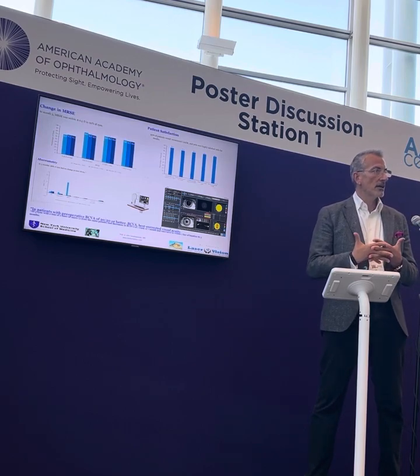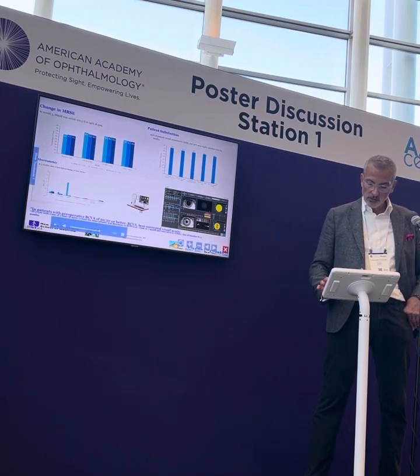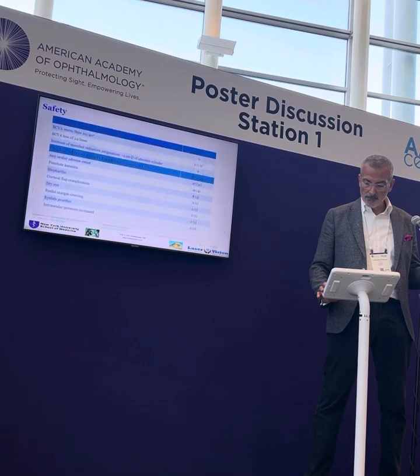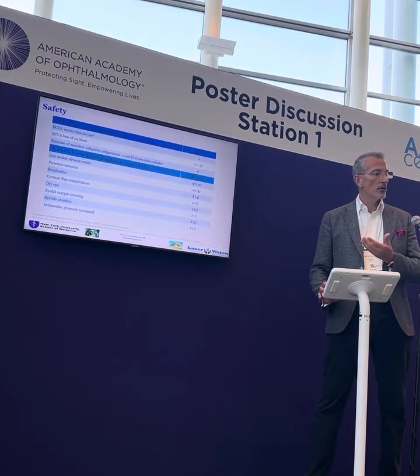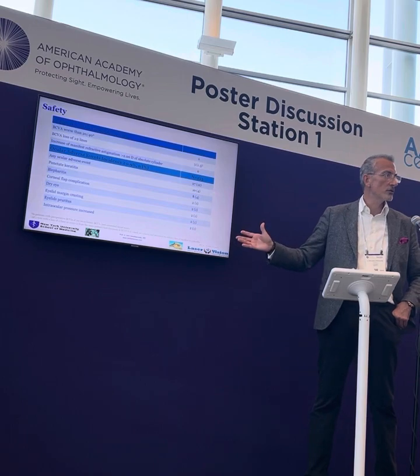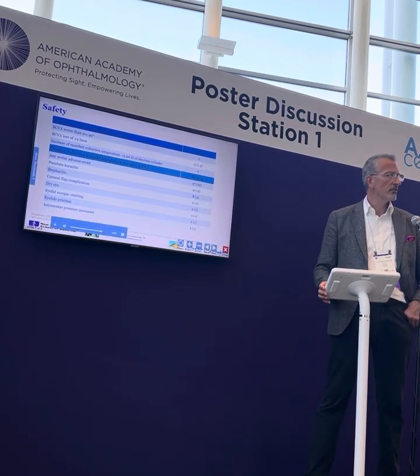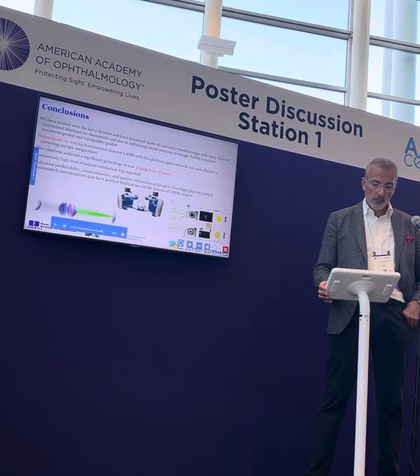especially when we're treating eyes over -3, even in the range of over -5. There was a very subtle increase in higher order aberrations, underlining the importance of correcting preemptively higher aberrations with this device. So as far as safety, this is a list of all the adverse reactions noted with these patients. We just had one incomplete flap in the group from Germany, and that patient was obviously excluded from the data.